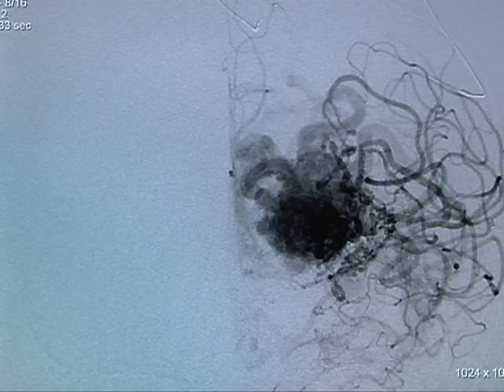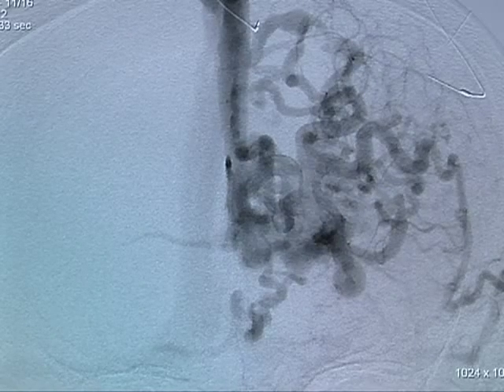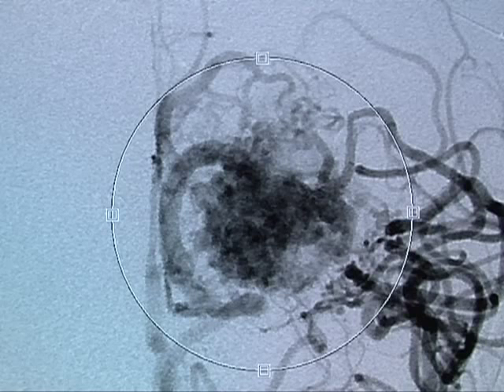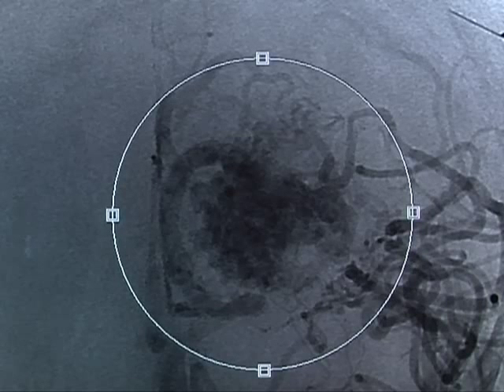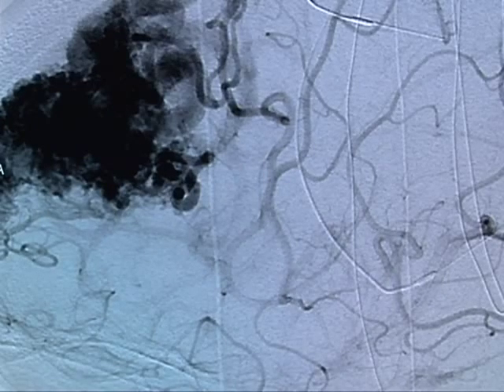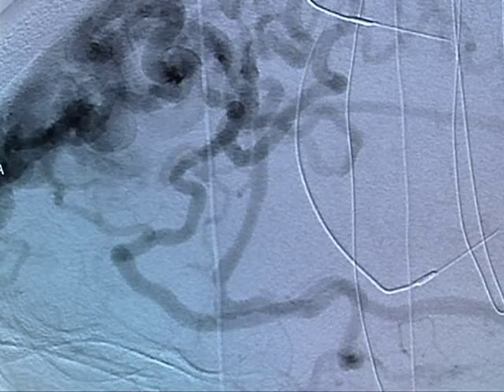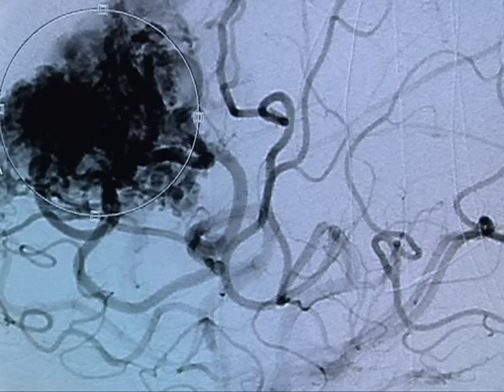This was the AVM prior to embolization. In total, we embolized six individual vessels that were supplying this AVM. This is the AVM prior to embolization — the area within the circle. A lateral view showing the AVM prior to embolization: the dense tangle of blood vessels represents the arteriovenous malformation.